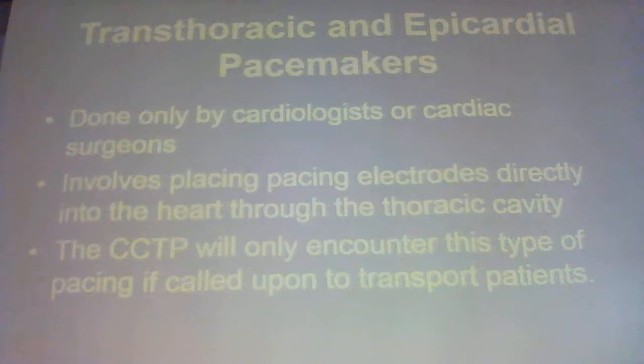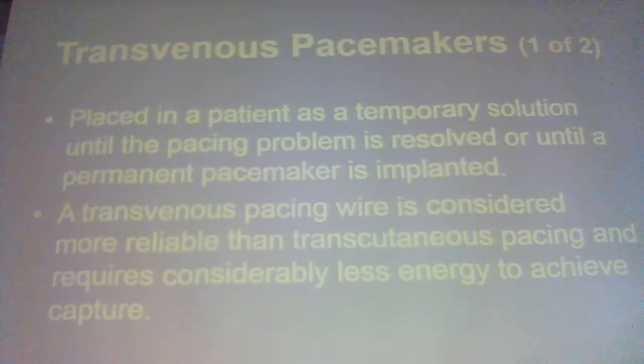So we talked about these already. The transthoracic and epicardial pacemakers, they just hook wires to whatever part of the heart they want to pace, and then they put that generator up under the skin. Batteries are good for 10 years usually, and then they have to replace them. Some places carry magnets to turn off the pacemaker in case it's haywire or in case they're in cardiac arrest or something. We had one of those at the Preston. We had the whole machine in there, and we brought them in. We could run the whole diagnostic, turn it off, turn it back on. It was only certain brands that we could do, but it was kind of a neat thing that sat there and collected dust.